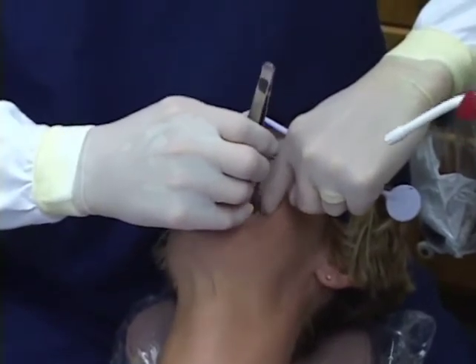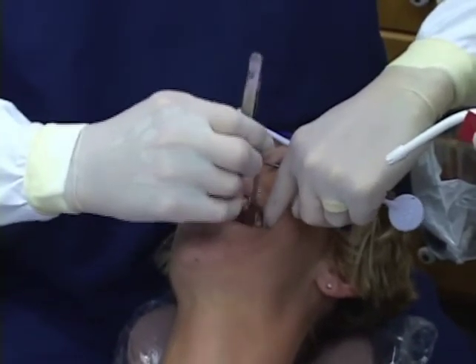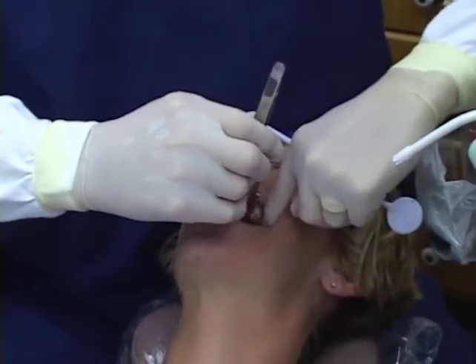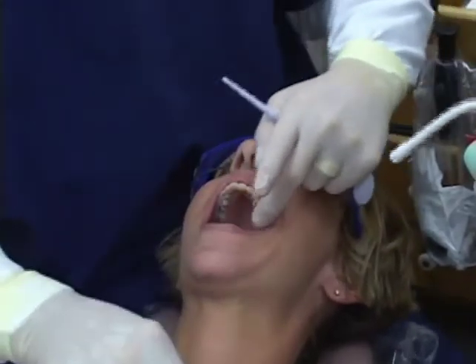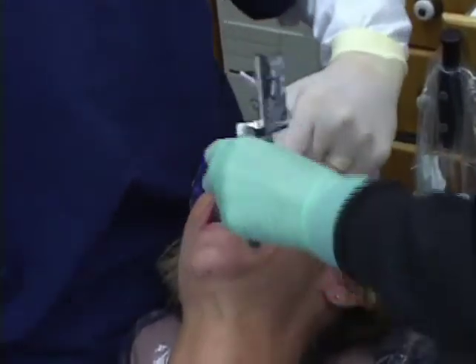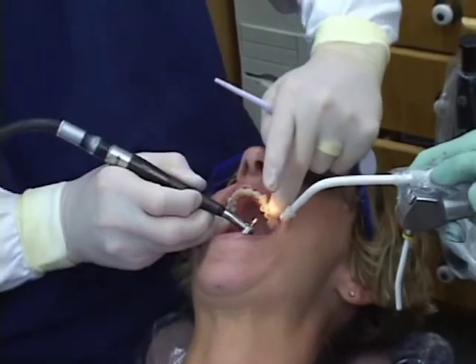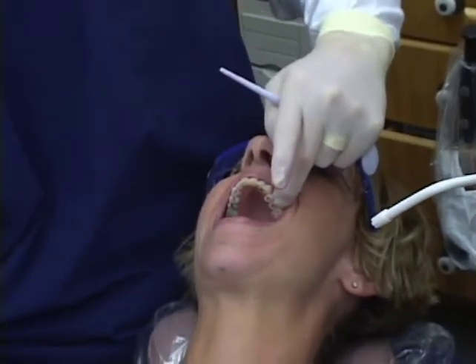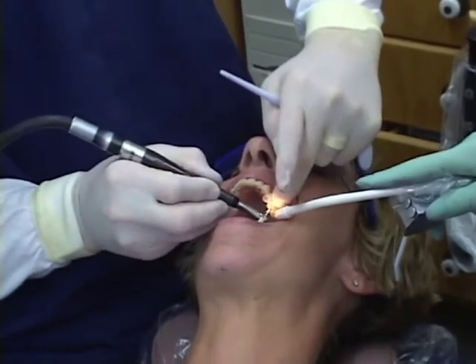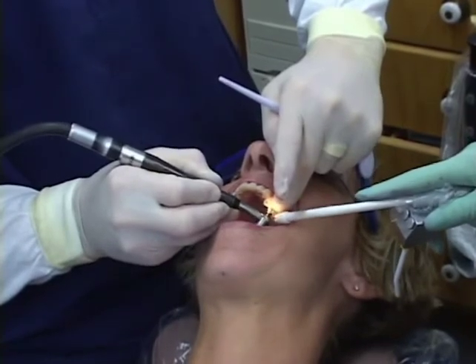Just bite down very lightly - that's holding. The shim is always a great way to check. It might be number 13. What if I over-reduce a stop here? The amount we're dealing with - I'm probably taking off maybe 5 to 10 microns. That tooth is going to erupt back to where it was within hours or days. So I don't want to be overly aggressive in reduction. If I inadvertently take something off, it's going to be back in contact really quickly.